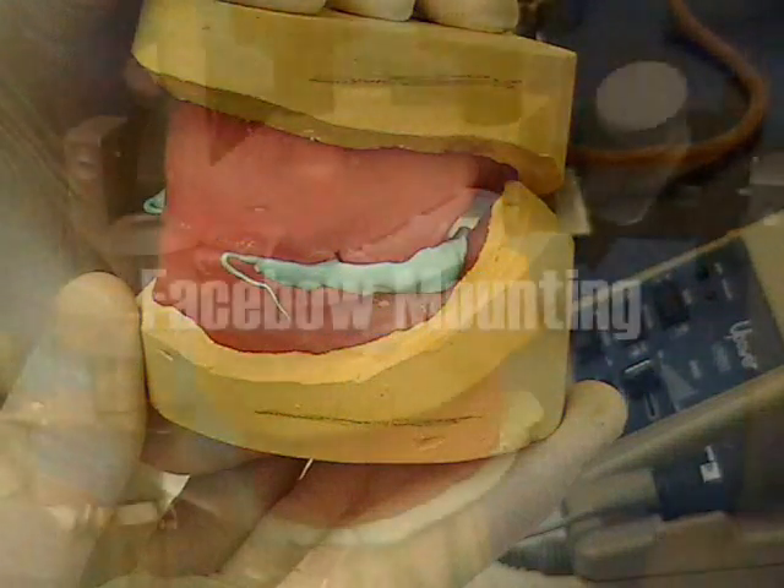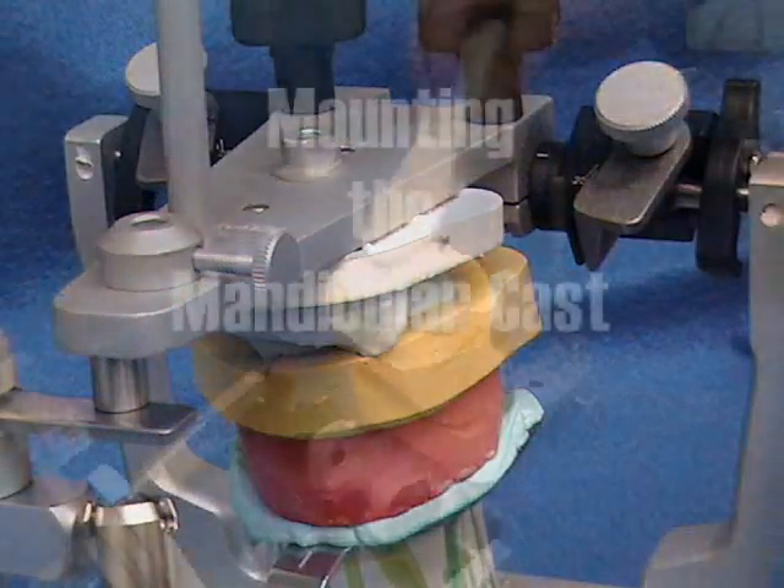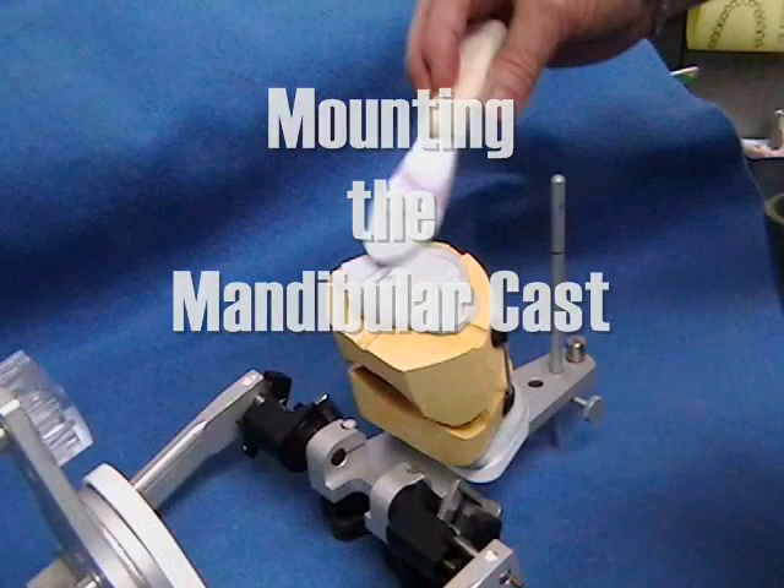A face bow is used to mount the maxillary cast to the articulator to duplicate the patient's arc of opening and closure. The mounting of the mandibular cast is completed using the record.